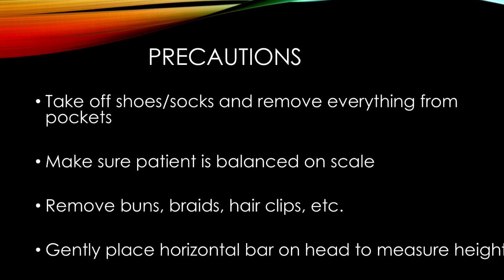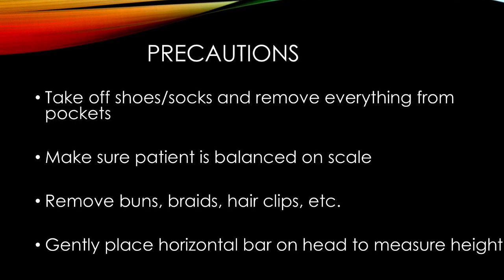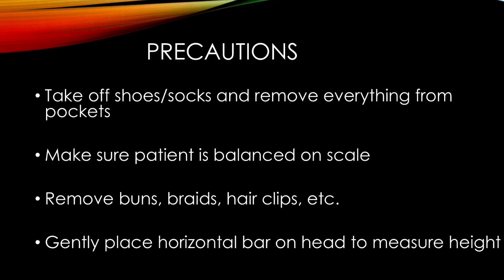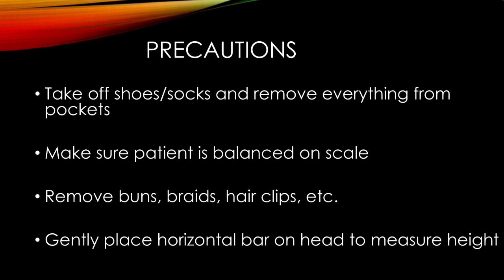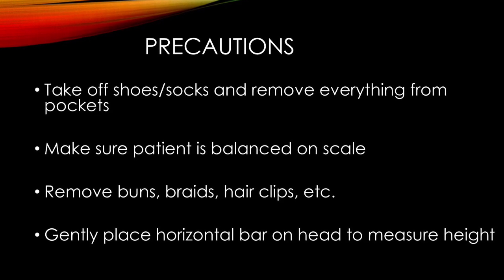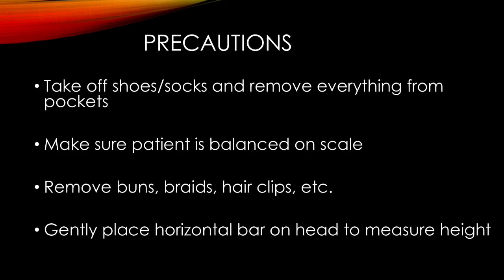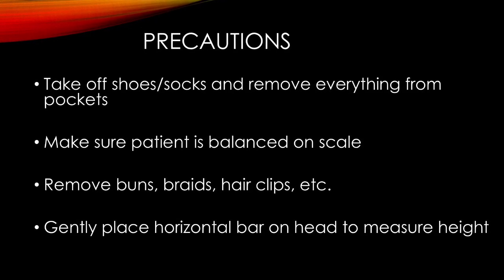A few precautions to remember when taking BMI is to make sure the patient has removed their shoes and socks and to remove everything from their pockets. Make sure the patient is standing all the way on the scale and is well balanced. For measuring height, make sure all buns, braids, or hair clips are removed. Gently place the horizontal bar on the head so you do not injure the patient.